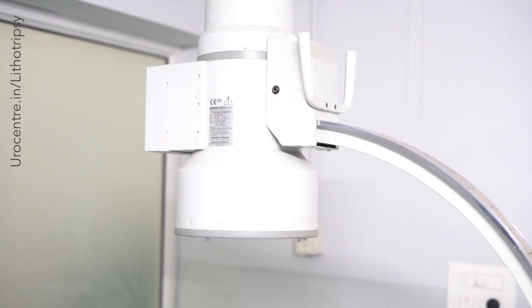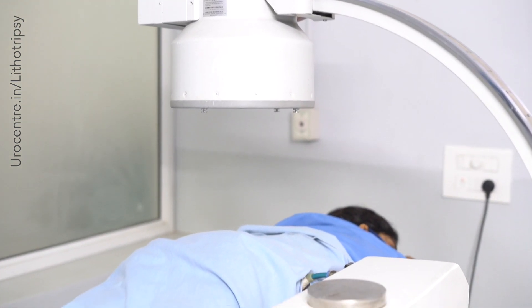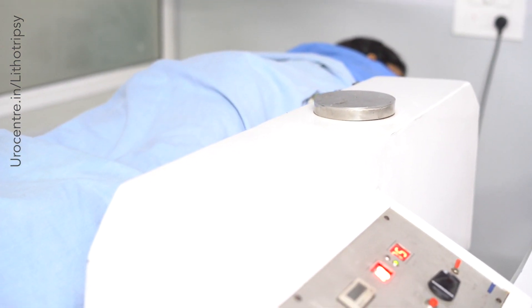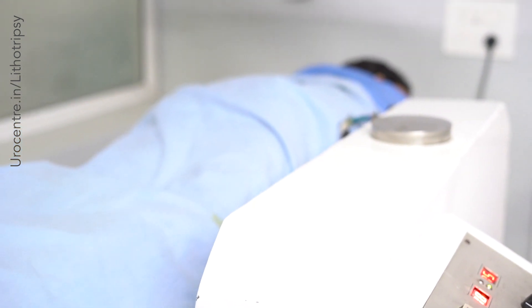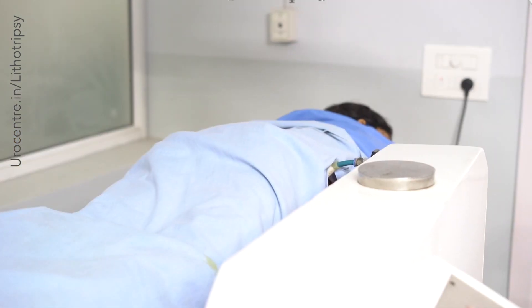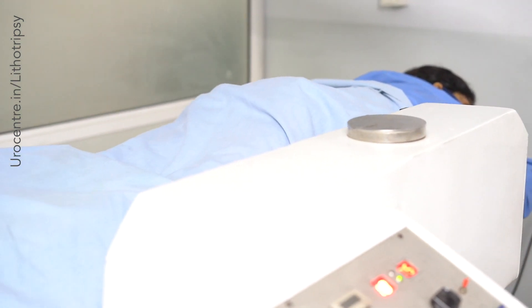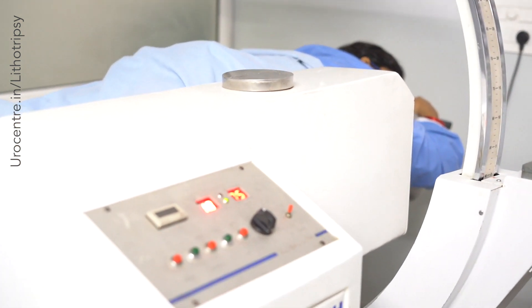This technique has been with us for the last 30 years, so we have a lot of experience with it. Compared to surgery, lithotripsy is a much safer option because there is no anesthesia, hardly any pain, and no hospital stay. Compared to laser surgery or retrograde intrarenal surgery, which have many complications, lithotripsy is a very safe option.